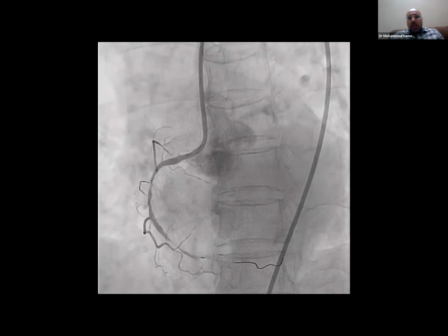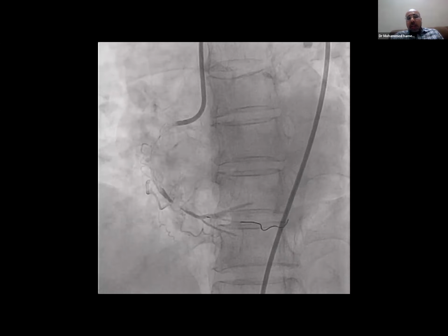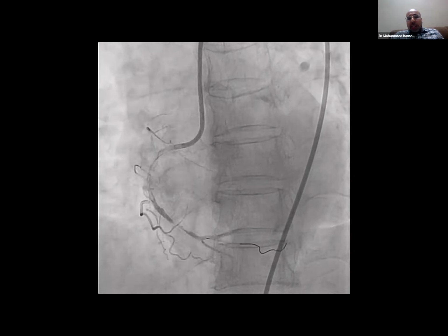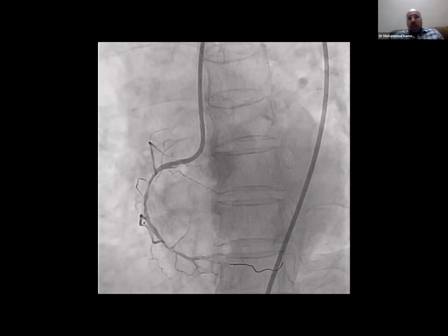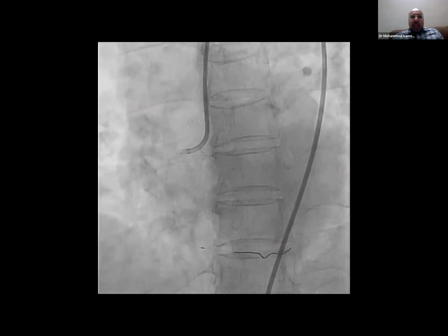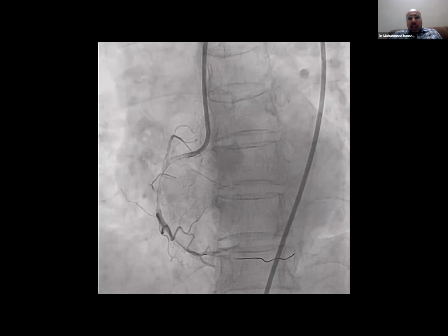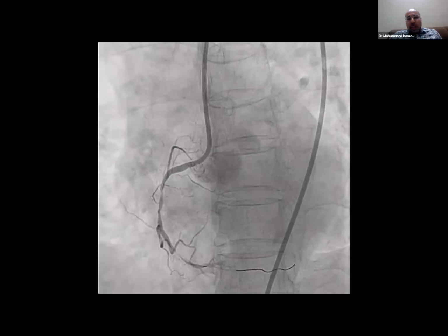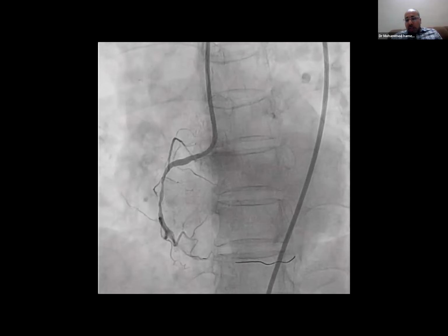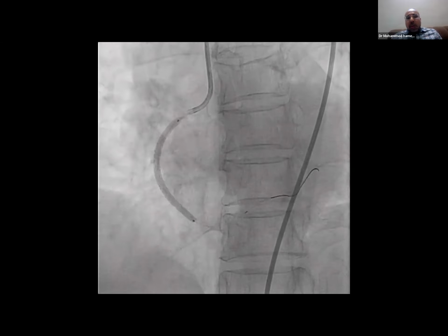It will be clear when we made better engagement with the catheter. You can see here we have a long lesion in the RCA. Of course, in the primary cases, direct stenting is better to avoid microembolization of the thrombus and to decrease the no-reflow. And in many cath labs which do not have this length of stents like 50, I think we have to put 2 overlapped stents. But thanks to Nagomi technology, they offered us the long 50 mm stent, and we did that at this time. A 3.0 by 50 stent was deployed directly at the lesion with magnificent results.